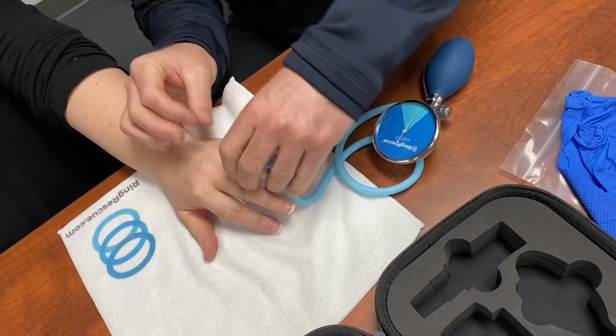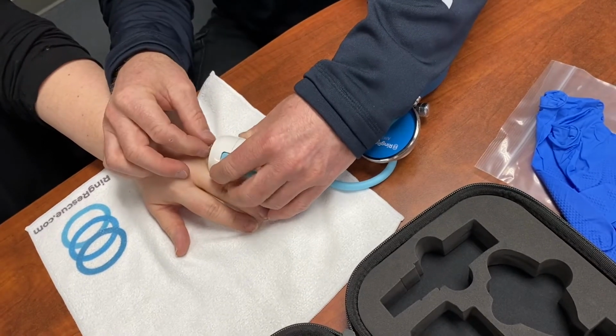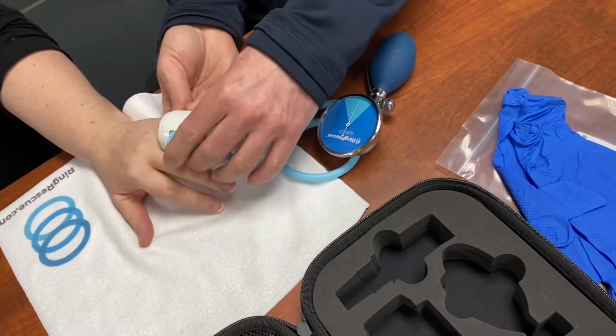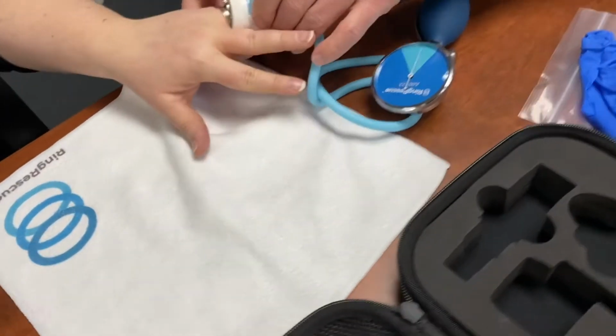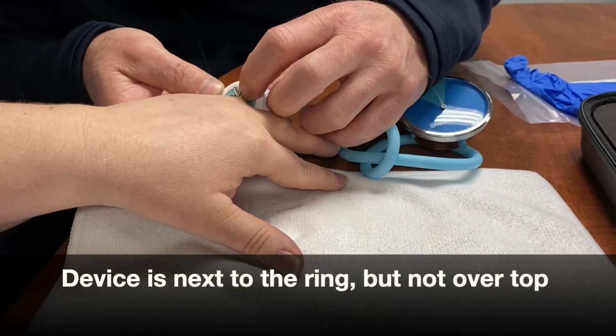I'm just going to take a look here. That looks pretty well lined up there. Okay, so you can see that the device is right up against the skin right next to the ring. It's not really over top of your rings, okay? So it looks pretty good.